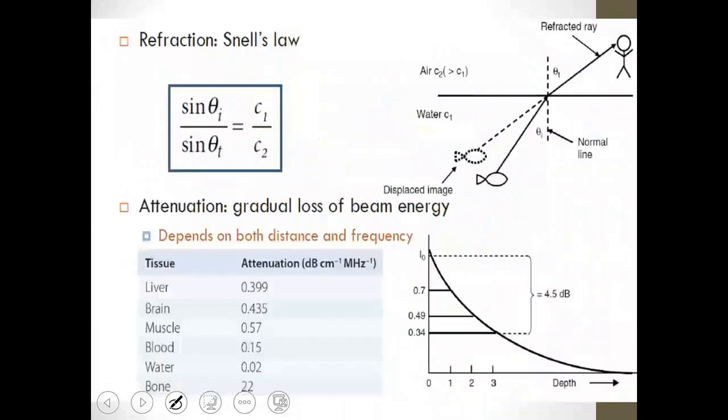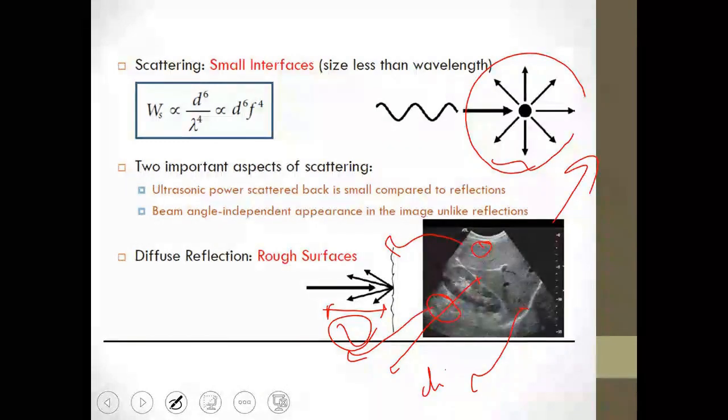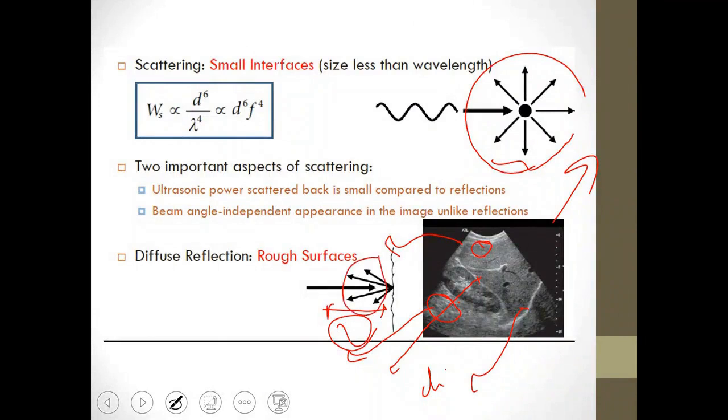Just a moment, please. When it encounters a surface, it becomes a reflective surface, resulting in reflection that appears as scattered reflection, giving you a signal that resembles this kind of signal. As a result of the interaction between the pulse and the reflective surface, if the pulse that is coming down meets a smooth and strong surface, like the diaphragm, reflection occurs, which we all talk about, and this reflection starts to give you a hyper signal in that area.